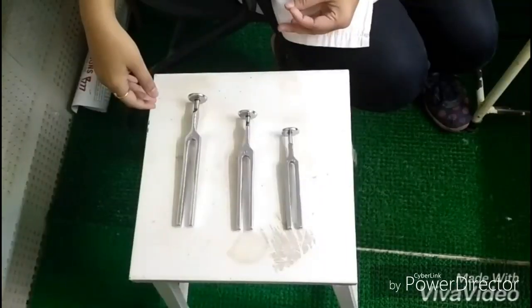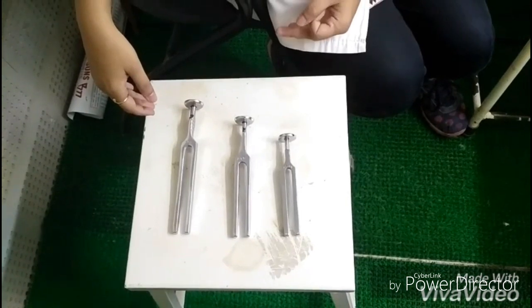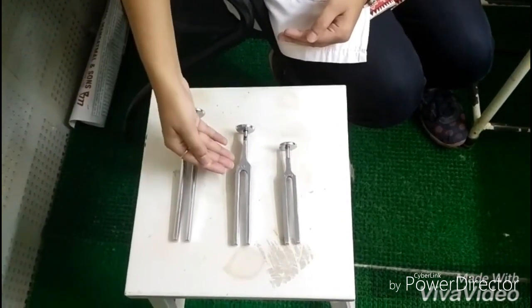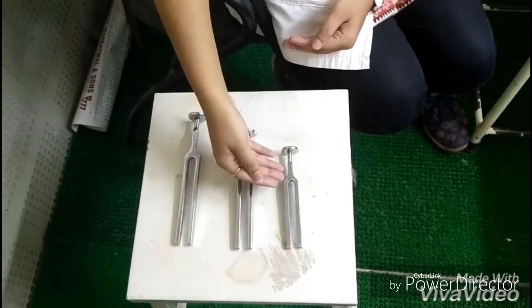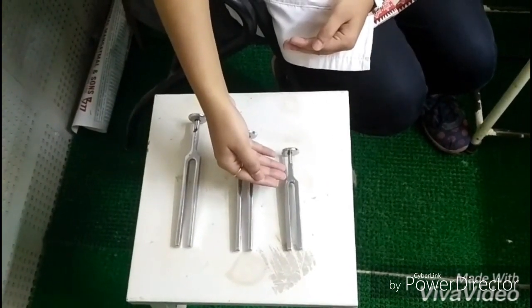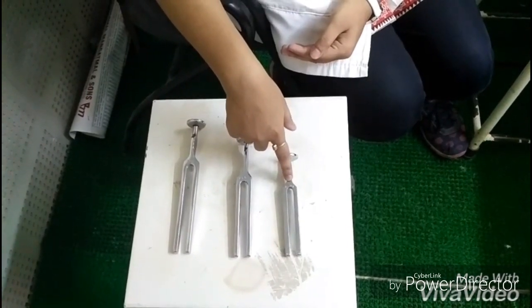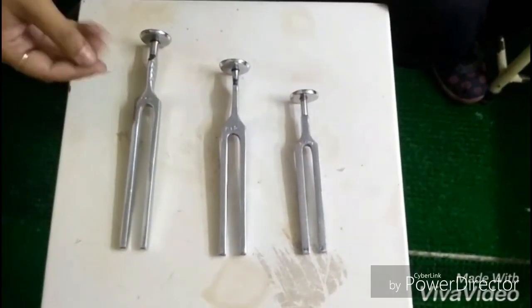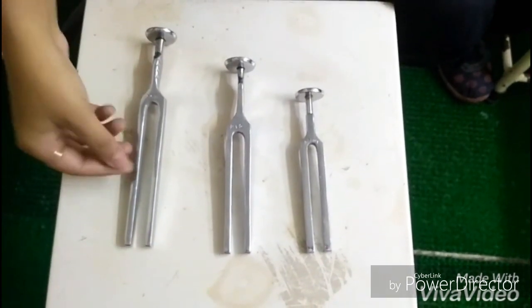First, we are going to acknowledge the tuning fork. In ENT, we usually use three frequencies: 256 Hz, 512 Hz, and 1024 Hz, which you can see written on the base of the tuning fork. The parts of the tuning fork are: base, stem, shoulder, and prongs.